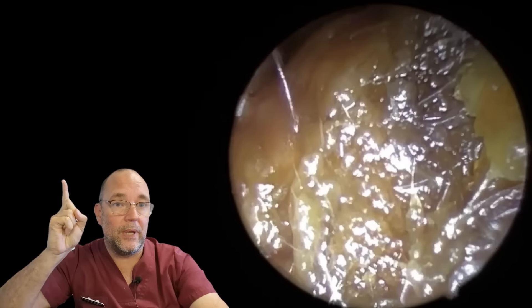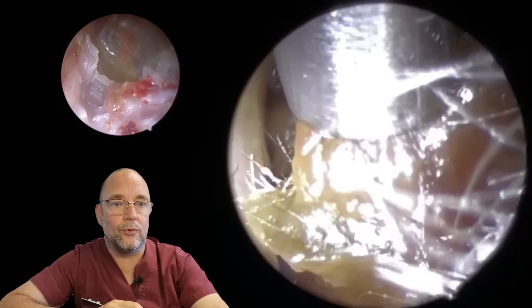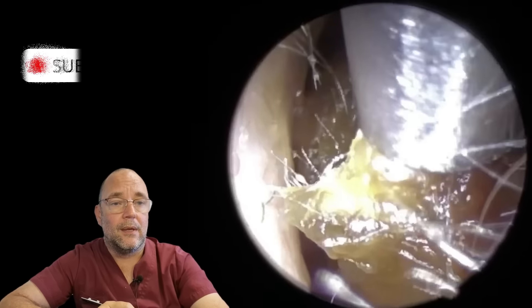Hello, good afternoon, good morning, good evening and welcome. It's Nurse Richard, the Wax Wizard. Thanks for joining me. Now, this is a really interesting one, and I'm just going to show you above me here what this ear that you're looking at now looks like after we've removed this.